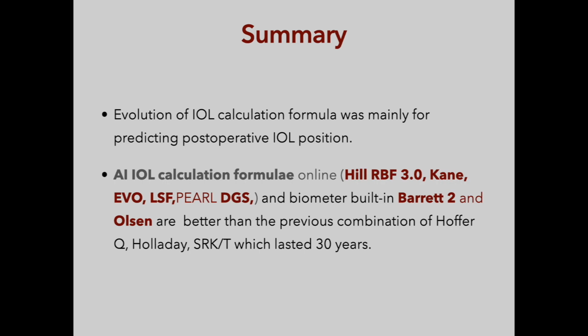The evolution of IOL calculation formulas was mainly for predicting postoperative IOL position. Newer formulas Hill RBF3, Kane, EVO, LSF, Pearl DGS, and Barrett 2 Olsen are better than the previous combination version, which lasted 30 years.